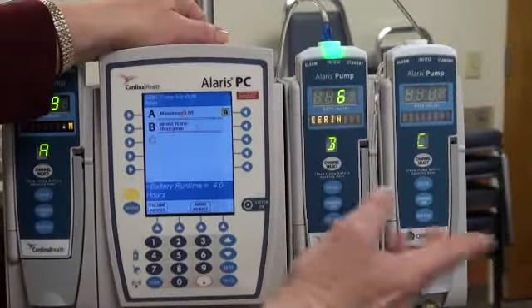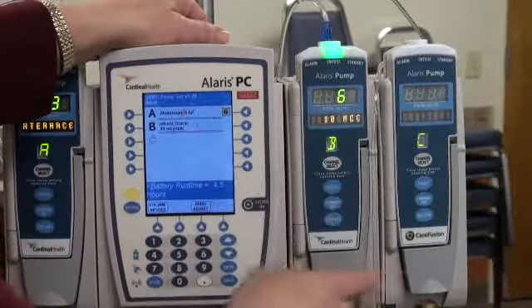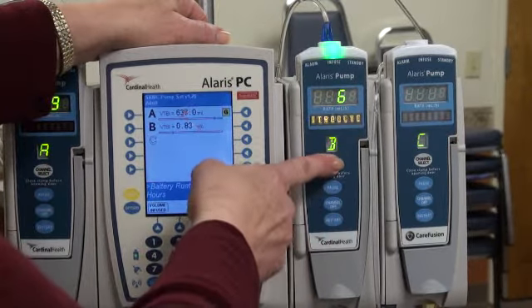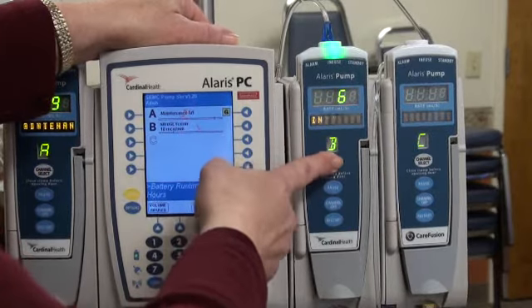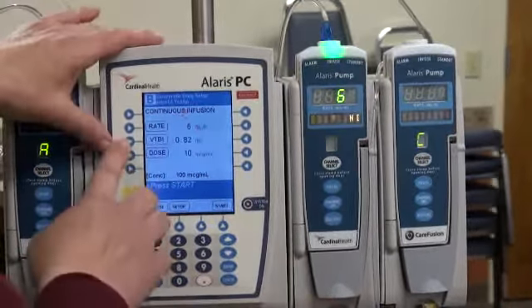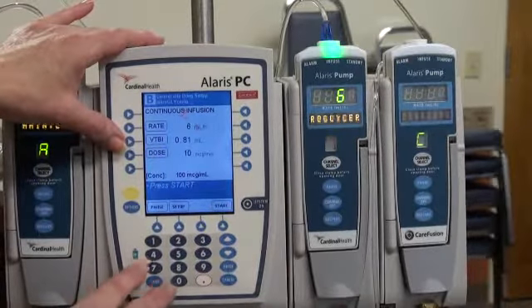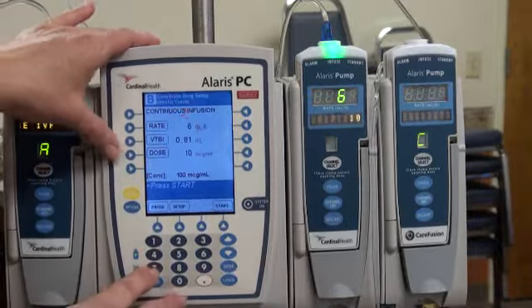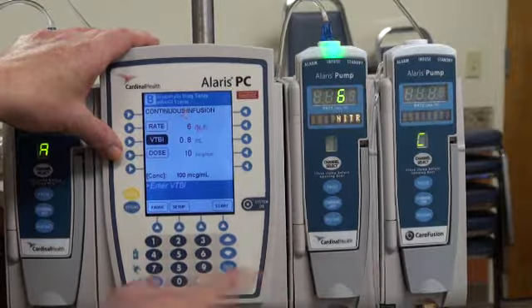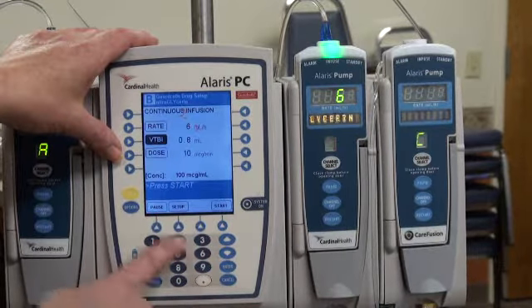Say you're going down the road, and your nitro's beeping again. Your volume is completed. Your nurses had the volume set for their half-hour checks, and they forgot to change it. You can hit volume, and you can set it for whatever amount you want.